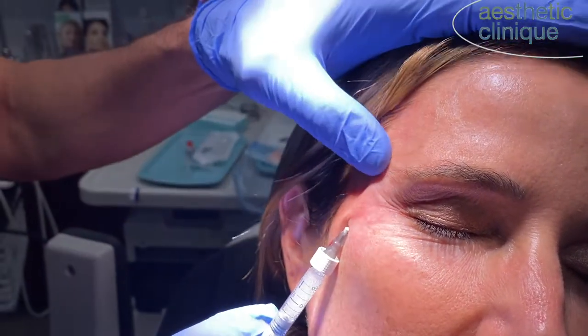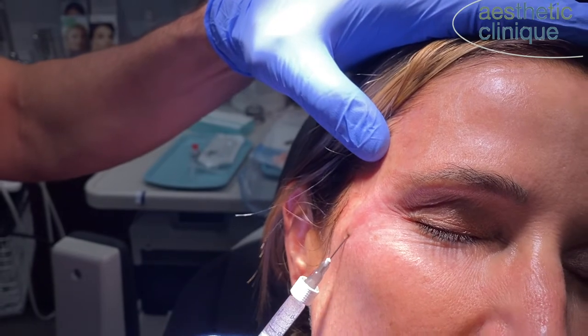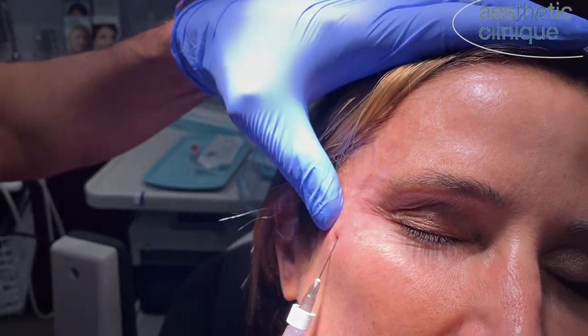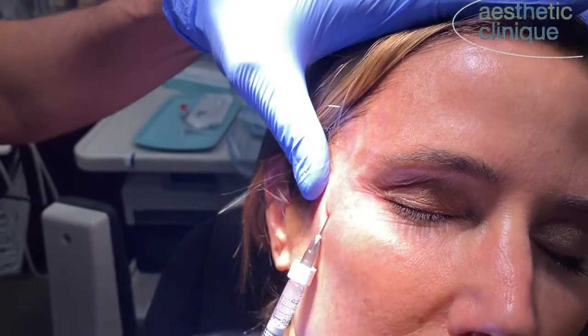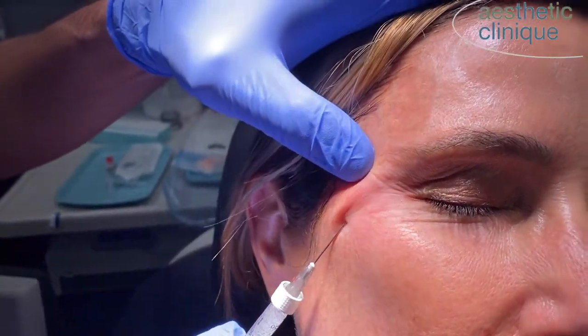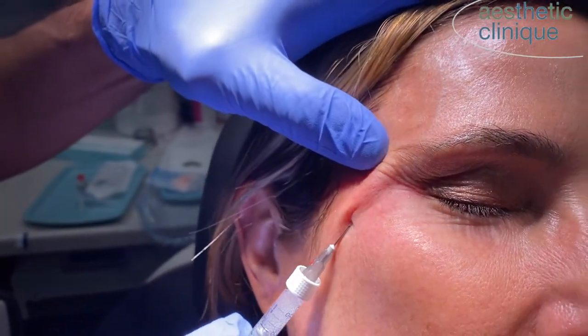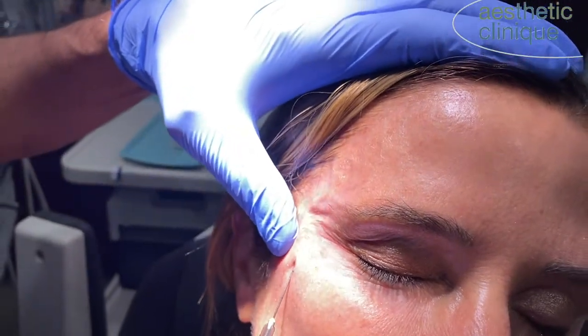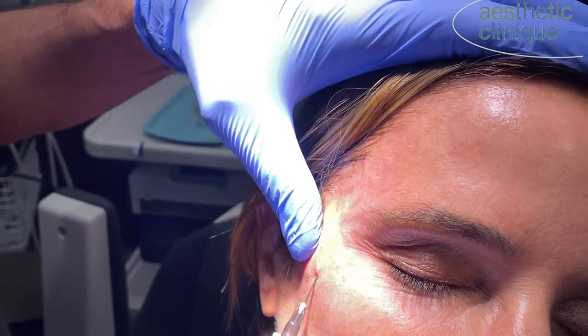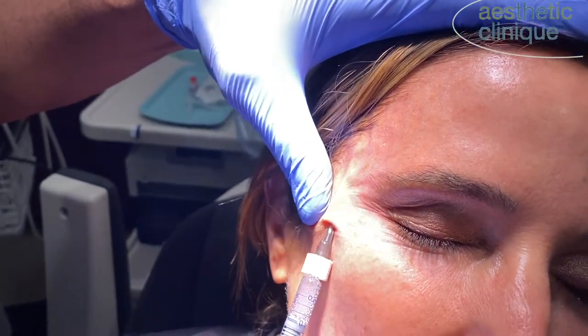Now I'm going to do a retrograde approach to that, and I'm constantly moving — that's the key. Constantly moving. It's a retrograde injection. I like the diluted Restylane because it smooths it out a little bit better.